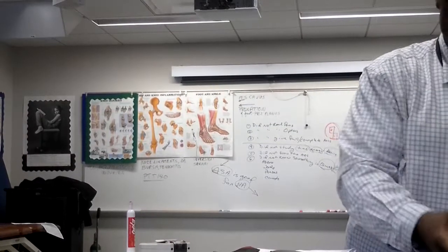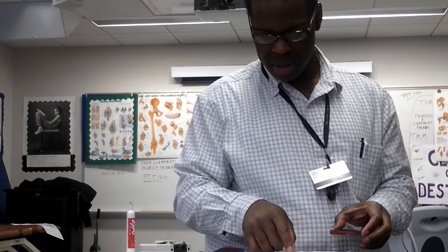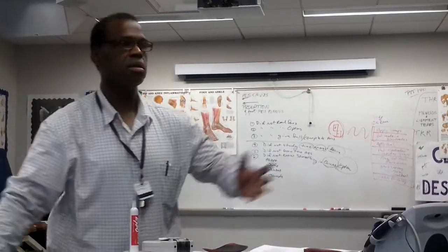It's still the same thing, regardless of what you put there. Okay, quadpolar: 4 pads, 2 channels, same size, crisscross. Good.